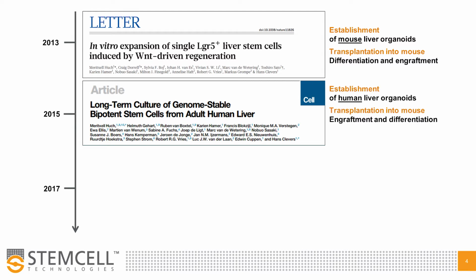It also demonstrated that organoids derived from liver biopsies of patients with inherited liver disorders do preserve the pathophysiological disease signature. This finding confirmed the enormous disease modeling potential of organoids, including the dissection of molecular pathways that underlie disease and the development of new drug therapies targeting these disorders.